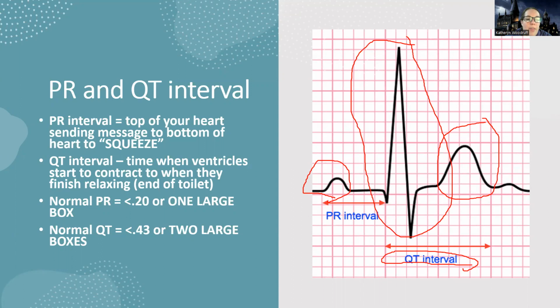And what they're talking about there is that the QT interval is really how long it takes the ventricles to do their job, and then how long it's taking that toilet to refill. Now, if that toilet takes a long time to refill, man, my heart's going to get impatient. It's going to say, man, you're taking way too long to refill.